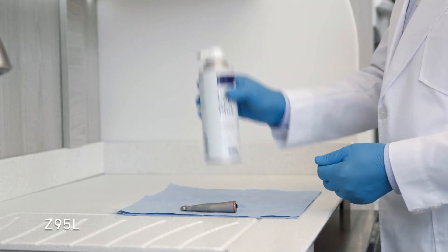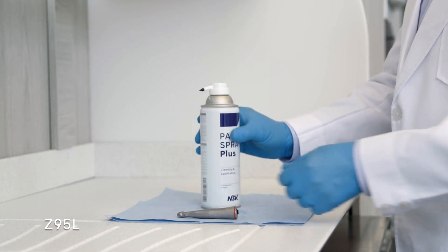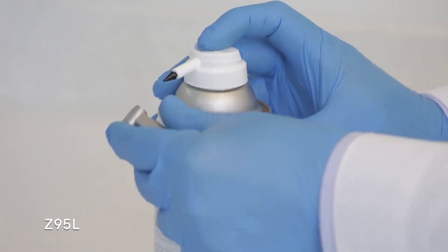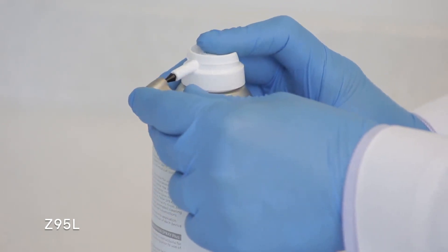For the Z95L high-speed attachment, shake the can three to four times. Hold the can in an upright position. Insert the nozzle directly into the chuck and spray for two to three seconds.